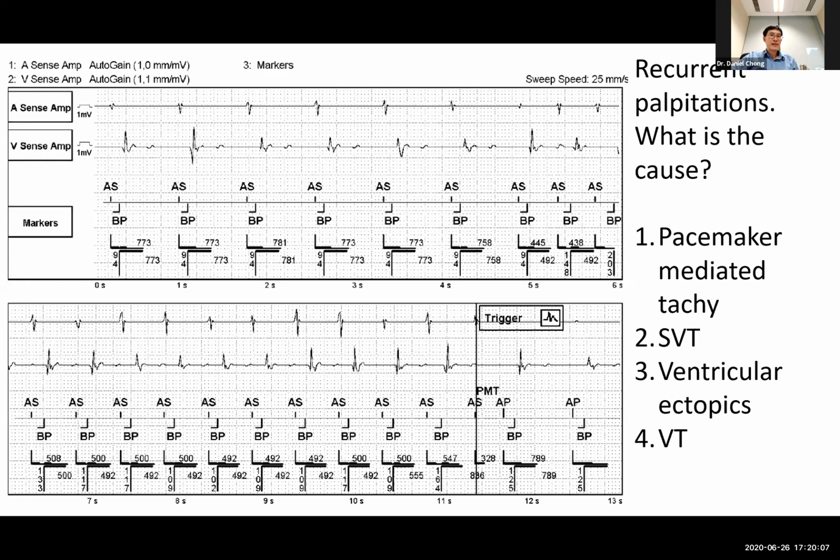Okay, all right, pacemaker-mediated tachycardia. Okay, very good. So this is pacemaker-mediated tachycardia. Maybe some thought it was SVT, and that would be a differential. But if you look at the tracing, the tachycardia terminated. There's an A sense and a B pace over here, and probably a PAC over here, or maybe a retrograde A, whichever started this episode of fast pacing, and it's being tracked, as we can see.